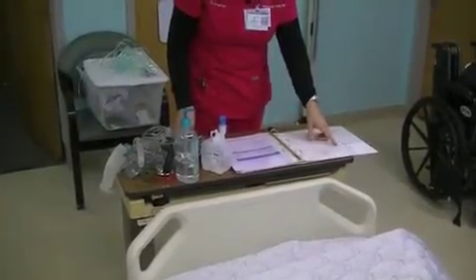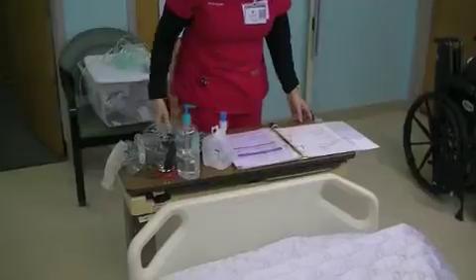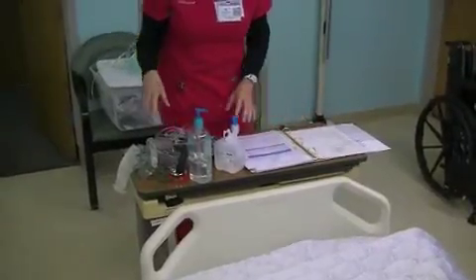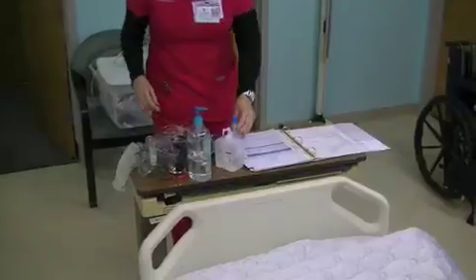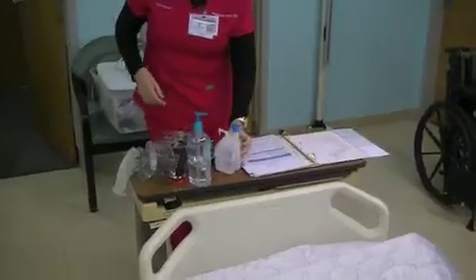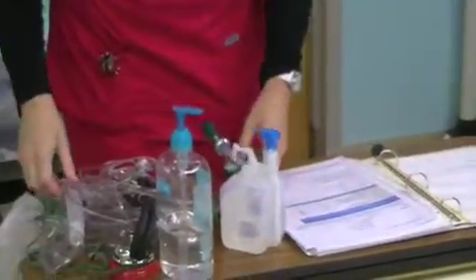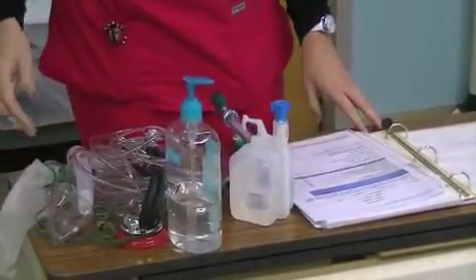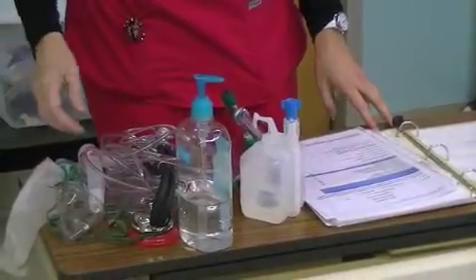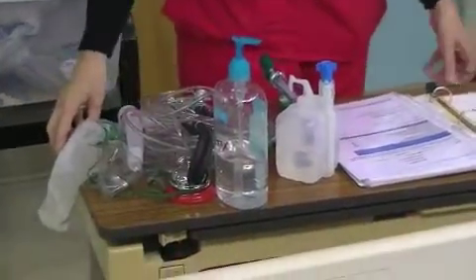Like I said, I'm going to talk about the different oxygen devices and what they deliver. We're going to get our equipment, and I'm going to show you the different oxygen equipment. We need a stethoscope, an Aquapack or a humidifier with sterile water in it, and a flow meter. We're also going to use what's called a nipple and nut, or another name we call it in the healthcare profession, a Christmas tree. And we have the different oxygen delivery devices: the Venturi mask, the non-rebreather mask, the nasal cannula, the simple face mask, and the face tent. We'll talk about each one of those individually.